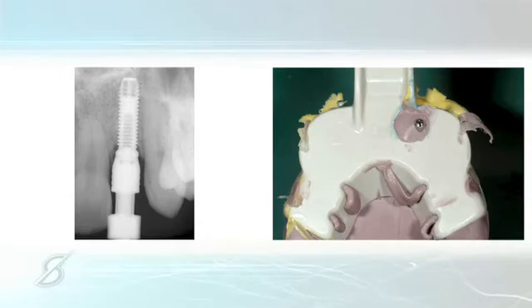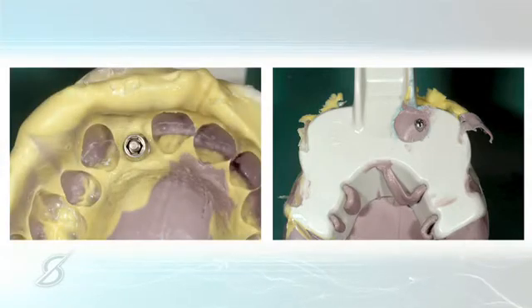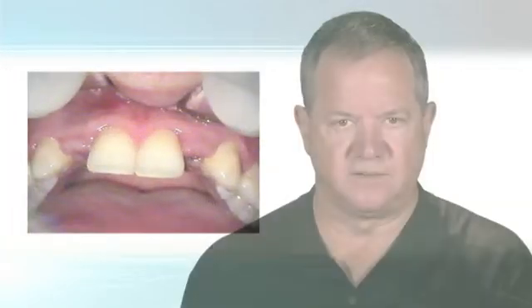So we've got our impression, and I want to make a pink soft tissue model because it's easy to carve. So the silicone that we use to make our pink soft tissue models sticks to this silicone. So we have to use some kind of separator.